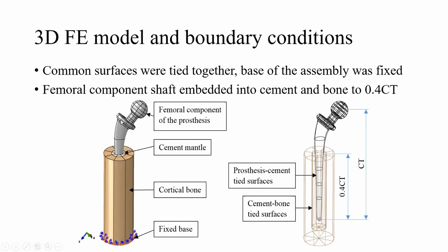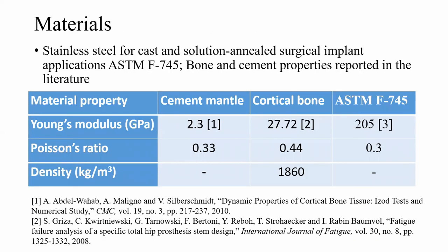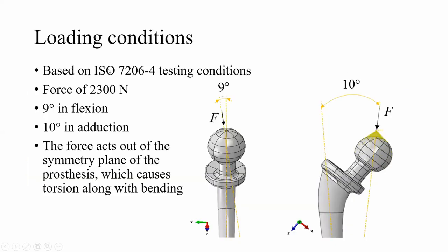Loosened femoral component shaft was embedded into cement mantle and bone. Common surfaces were tied together and the base of the assembly was fixed. Material properties of the stainless steel, cement mantle and cortical bone are shown in this table. Based on ISO 7206-4 testing condition, a force of 2300 N was applied at 9 degrees in flexion and 10 degrees in adduction. The force acts out of the symmetry plane of the prosthesis, which causes torsion along with bending.